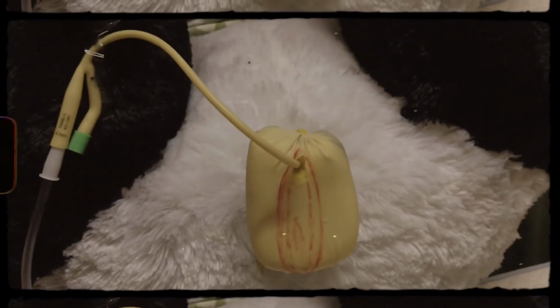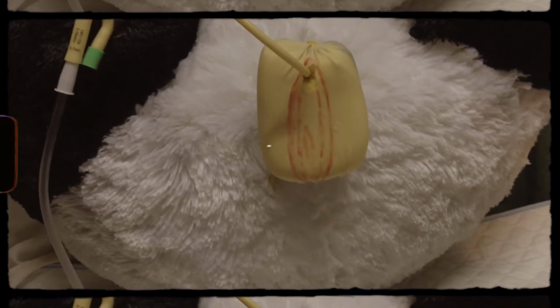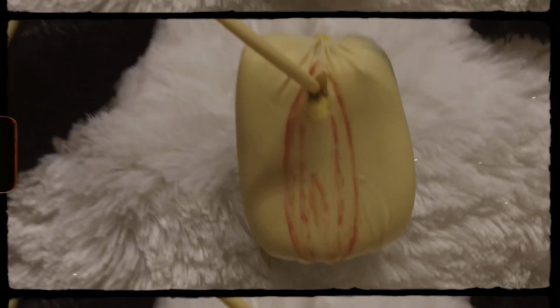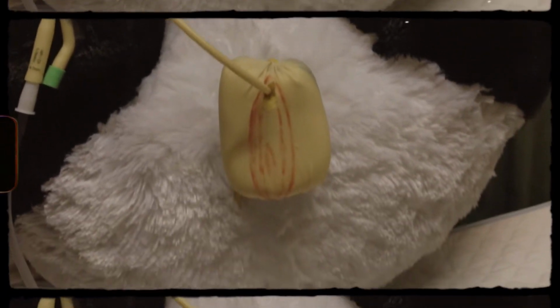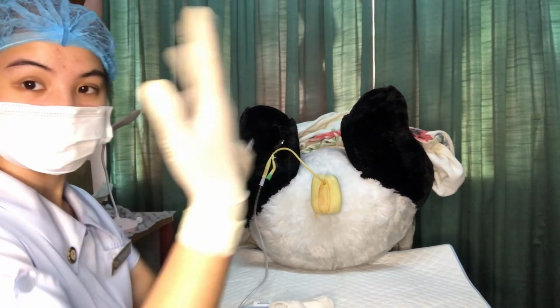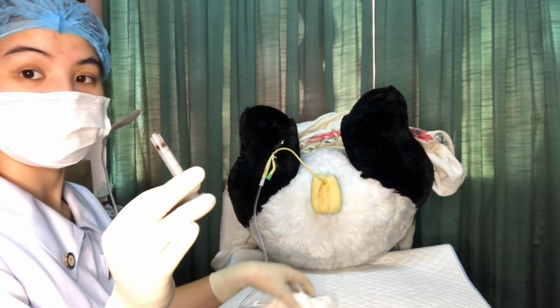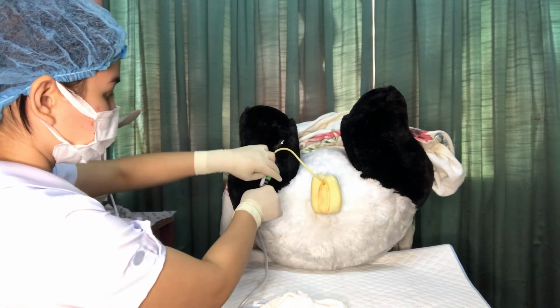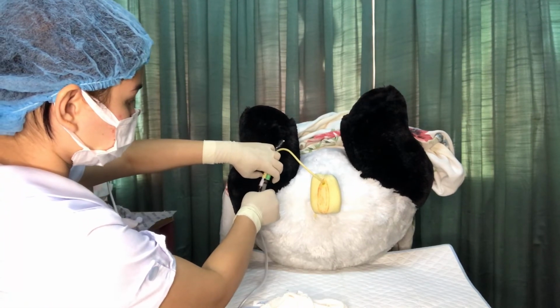So after doing so, don't forget to remove the gloves and wash your hands, and also remove all the materials that we've used. So this one is the Foley catheter. Don't forget to wash your hands and put on sterile gloves, PPEs, your hairnet, and then your mask, and then we're going to deflate the balloon.